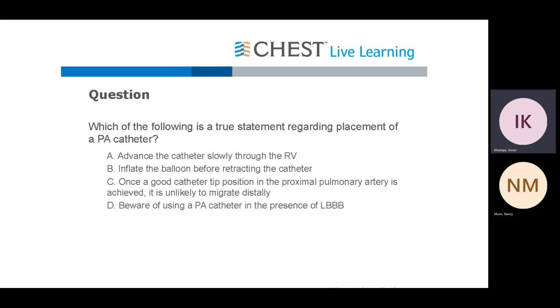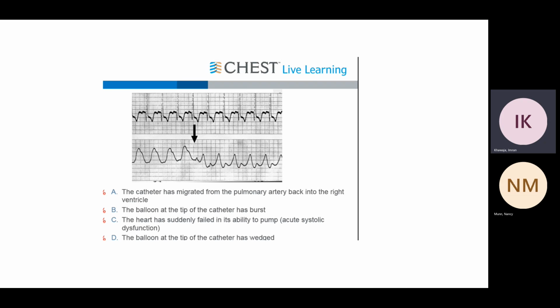And we said that you check that by seeing how much volume it takes to get you in a wedge position. If it gives you a small amount of volume, less than 1.25, it means that you are out, so you pull your catheter back and inflate to make sure you get the full volume to achieve wedge position. On the board, they will give you an EKG with complete heart block, and they will give you the options: back to pacemaker, inflate the balloon, and the question is just to distract. Right. That's the question.